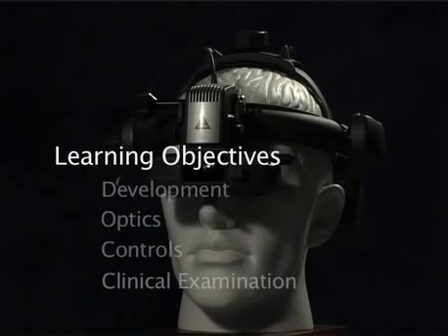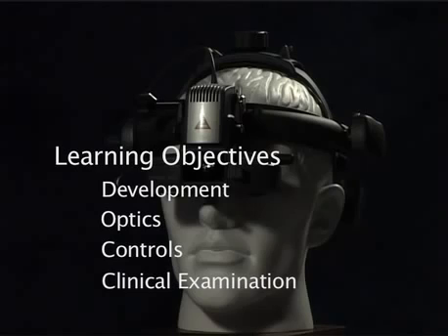In this video, we're going to cover the development of the instrument, discuss the clinically relevant basic optics, demonstrate its setup and controls, and finally take you through the clinical examination techniques that will help you get the most out of this unique optical instrument.